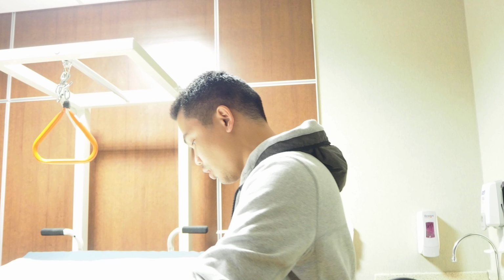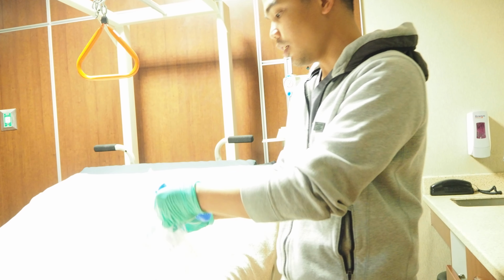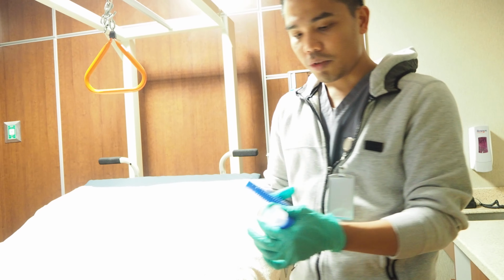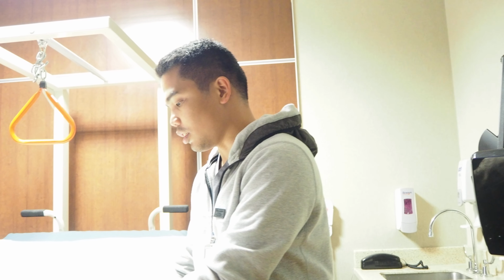Then put this one in this plastic container or bag, and the mouthpiece they can clean with sterile water. We should not soak it with soap, and then allow it to air dry and cover it with a clean tissue.